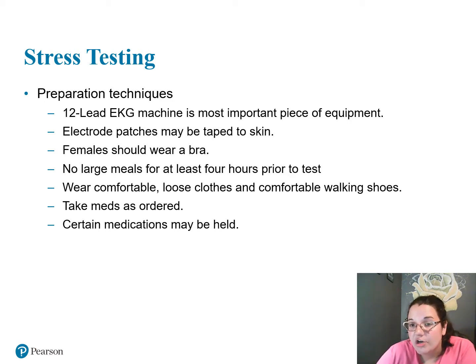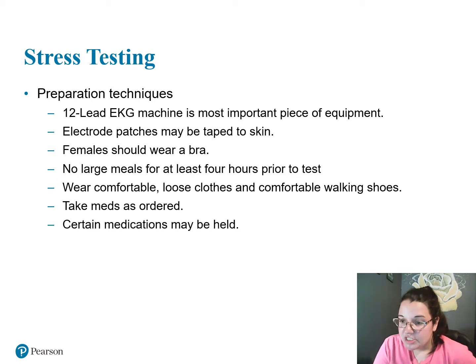Females are encouraged to wear a bra, and no large meals for at least 4 hours prior to the test. Meaning you don't want your patient to have a steak and then have to get on the treadmill after eating such a large meal. So you want them to be semi-fasting, meaning they can have their morning breakfast as long as it's not heavy and won't interfere with them getting on a treadmill. You want to wear loose, comfortable clothes and comfortable walking shoes.